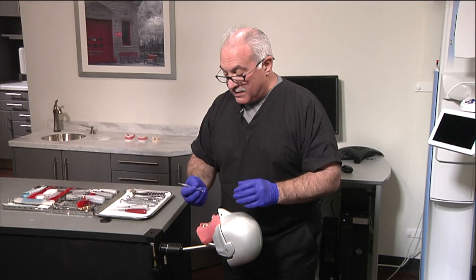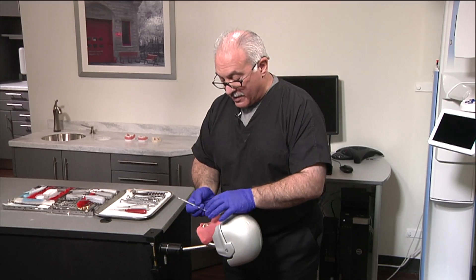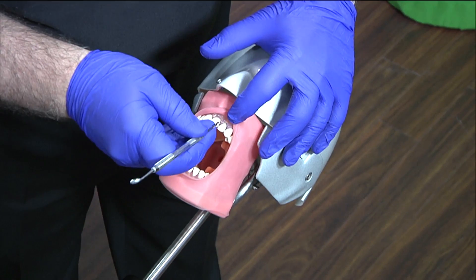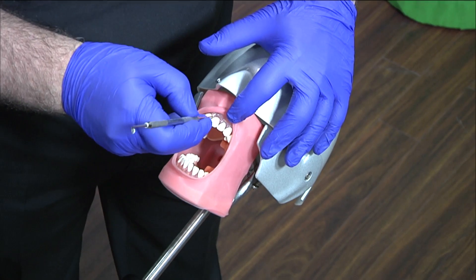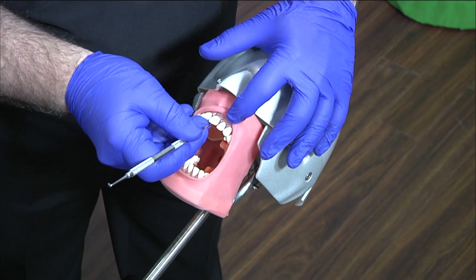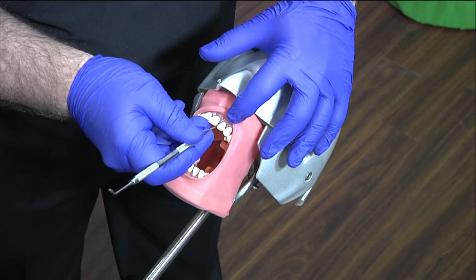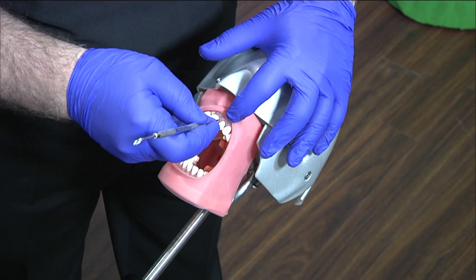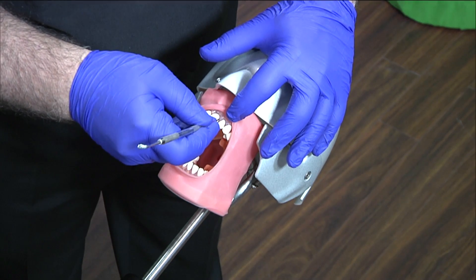Using the PH2, which is a very sharp, modified Woodson elevator, let's say I'm approaching tooth number nine. I use a finger rest. The patient's profoundly numb, and I'm verifying that with the instrument. I'm separating the sulcus attachment, and while I'm also doing that, I'm applying some deliberate apical pressure. Nothing's herky-jerky — it's deliberate, slow, steady apical pressure.